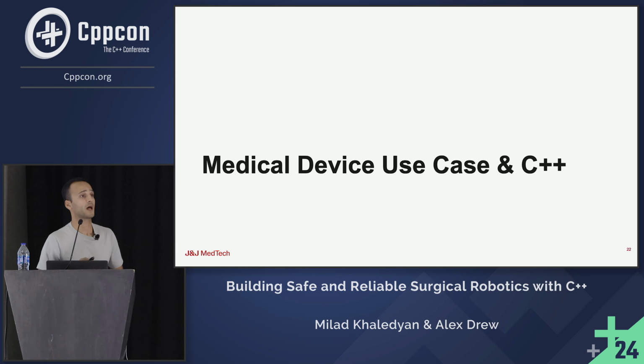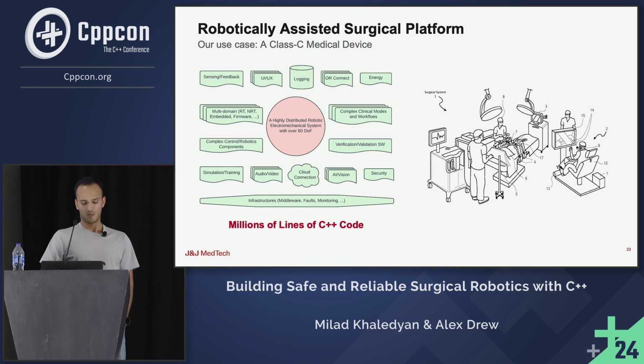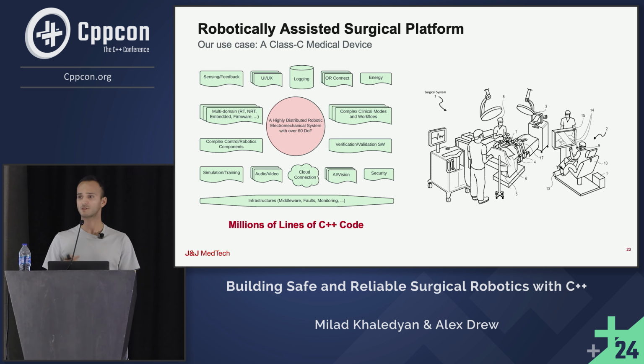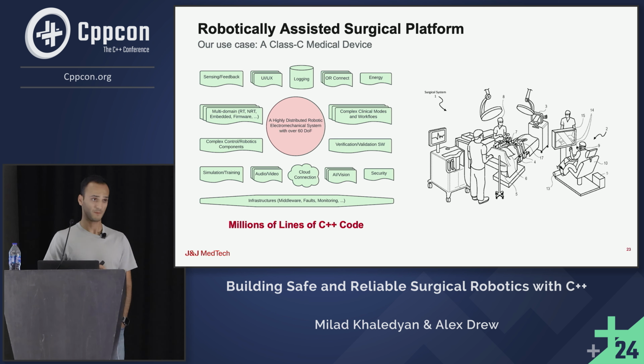So now let's talk about our use case where we use C++ in medical devices. For our use case, we obviously can't talk about many things because the product is not released yet. It has not even been submitted to the FDA, maybe anytime soon. We have a robotically assisted surgical platform. This system is a Class C product, so that means software failure within the system could cause severe injury or death to the patient, right?